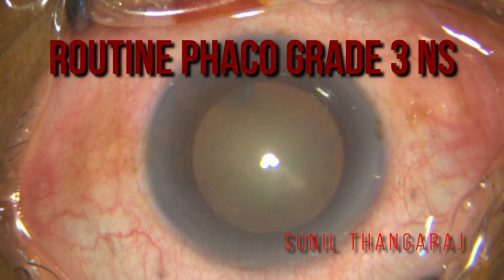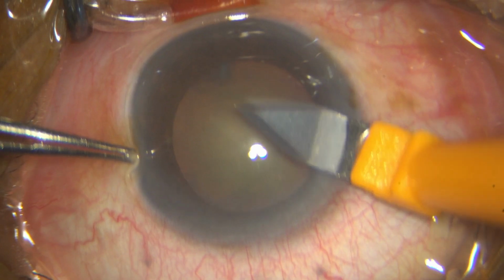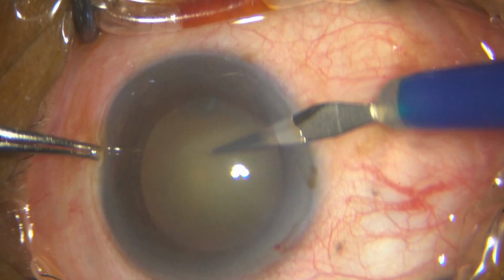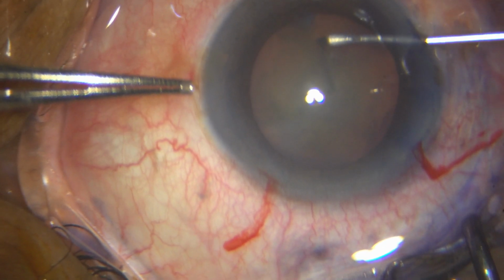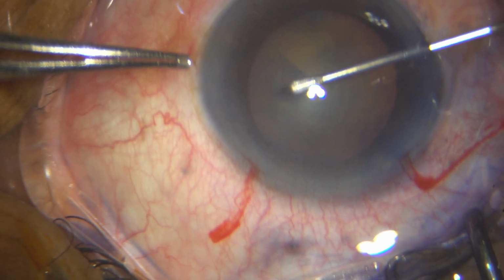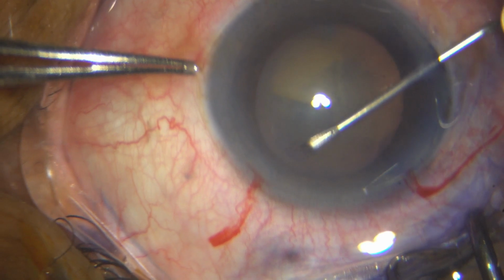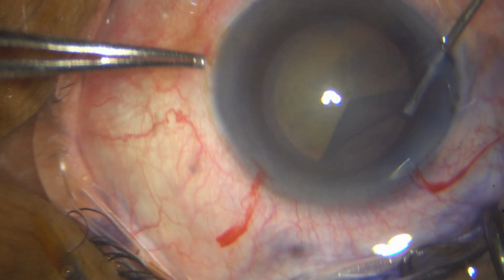This is a routine phaco emulsification done in a grade 3 nuclear sclerosis with a dense PSC, and after making my incisions, that is, a 2.8 millimeter incision and both the side ports, and staining the capsule with trypan blue due to the posterior subcapsular cataract. The red reflex was not so great.